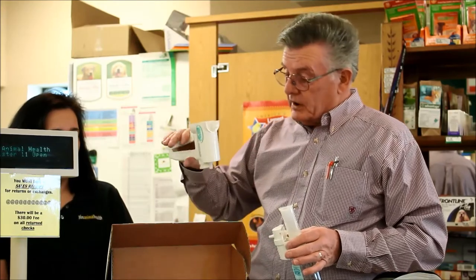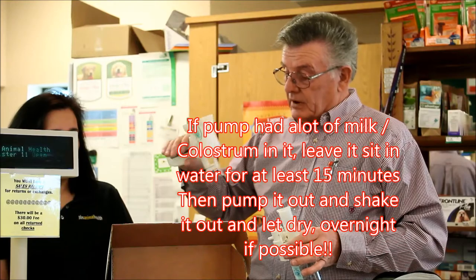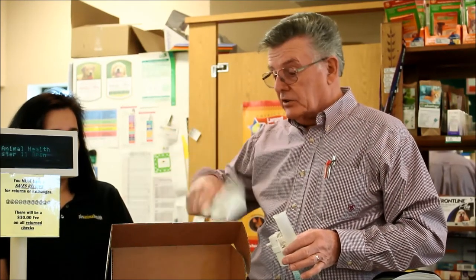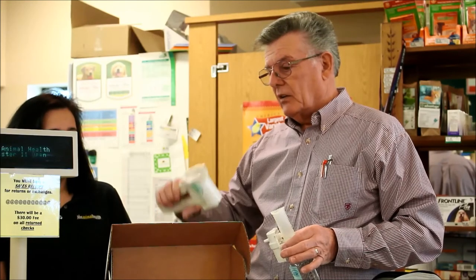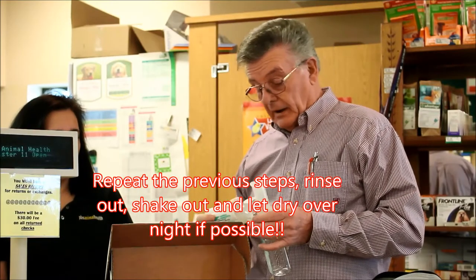Then once you get out, always hold it upside down — because if you don't, you get squirted right in the face. Clean it out, shake it out. Then go ahead and put it in the other side of the sink with good warm clear water, rinse it out and do the same thing. Shake it out and then let it dry, preferably overnight. And then you're good to go.